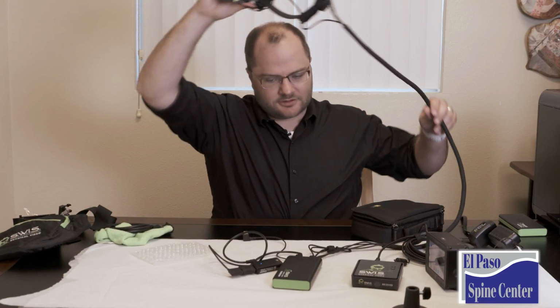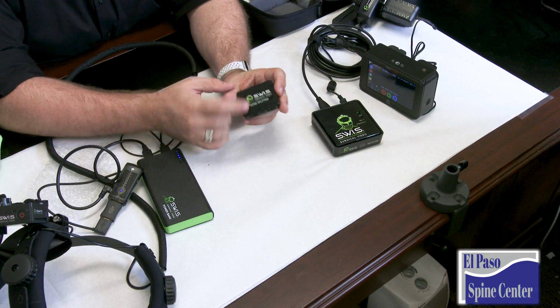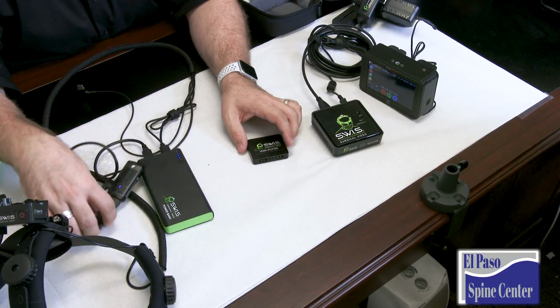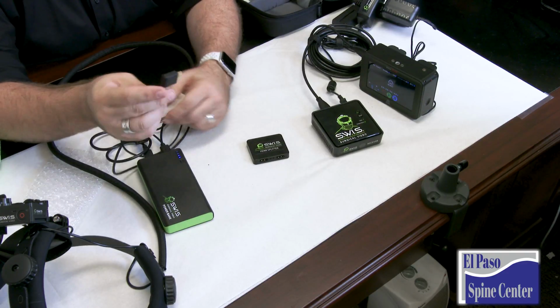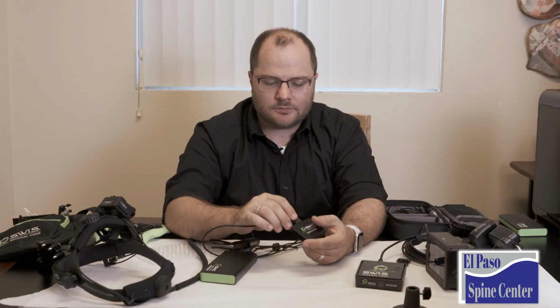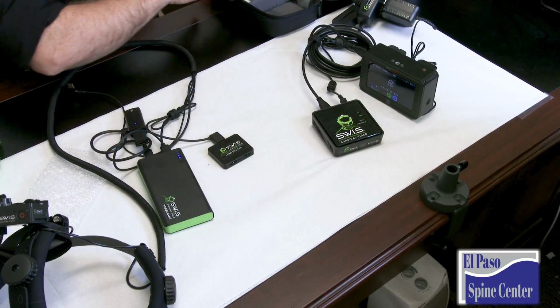But we're going to look at one other piece of equipment, and that is an HDMI splitter. What this does is it takes one HDMI input and it sends it out to two signals, full-size HDMI. So I'm going to take my full-size HDMI out of my wireless transmitter. Remember, the full-size HDMI is what's coming out of the GoPro. I'm going to plug this guy in right here, and I get a red light because I need power to actually split the HDMI signal.